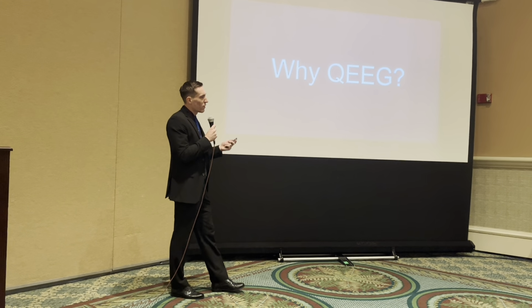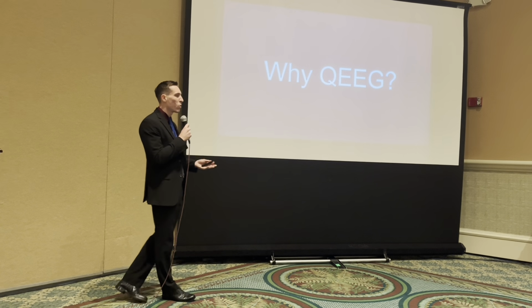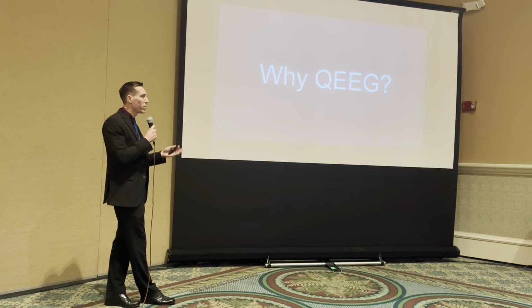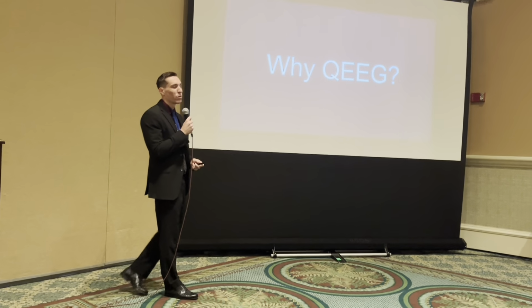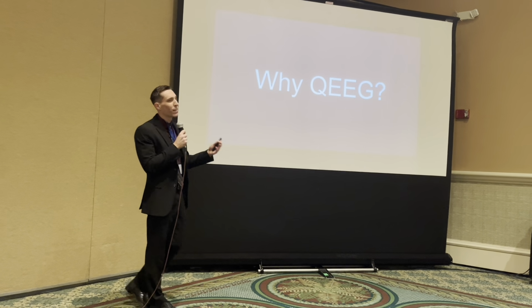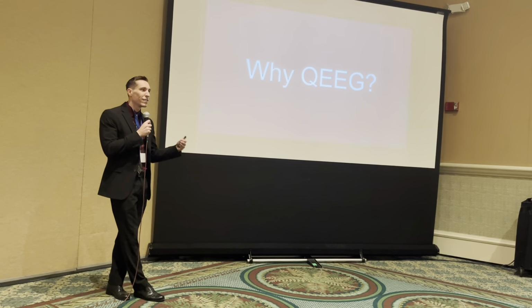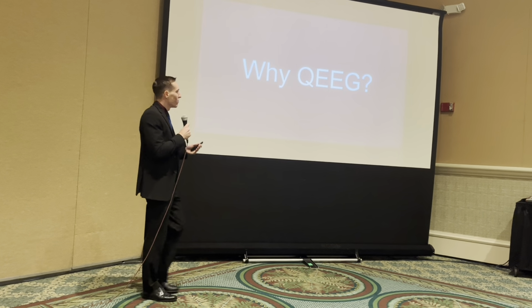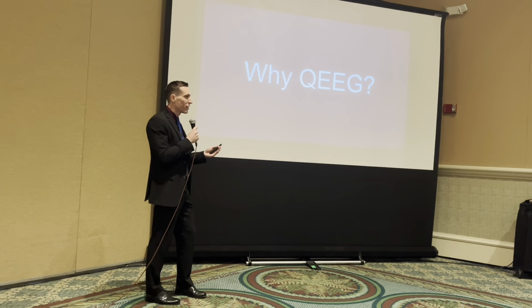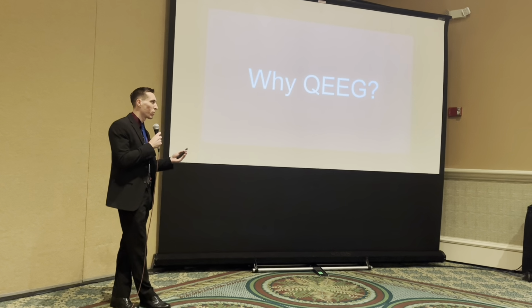So you have to go back to when EEG first started, when we were recording on paper and pen. We were really only able to record essentially short recordings. Now that we have computers, we can record multiple day studies, and that's creating a larger burden on the neurologist to go through all this new data that we're able to capture.